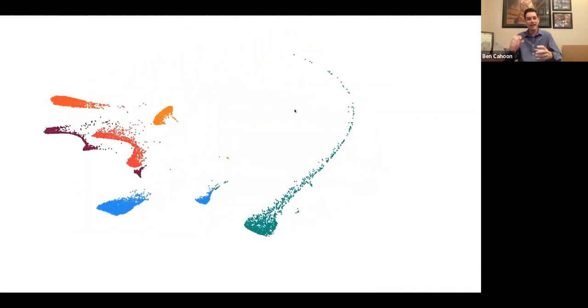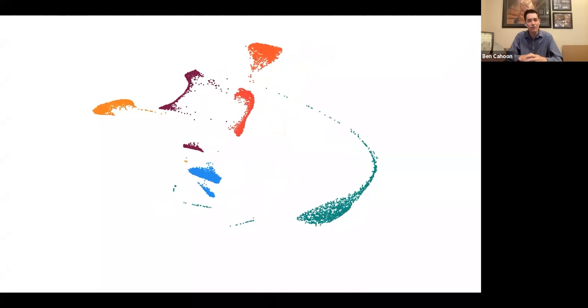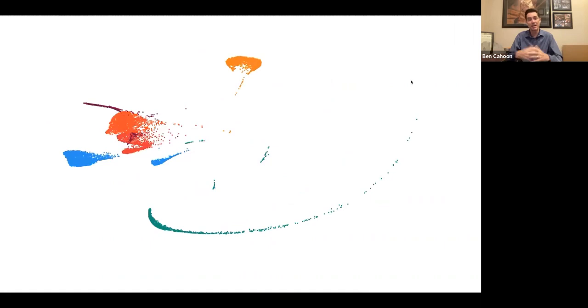So this 3D visualization helps us then select the areas that may not be right, if there's colors overlapping, we can select each of those images and change them. If it was a mistake or something just happened to the data set, we can clean that up, and it goes from taking months to clean it up to literally days.